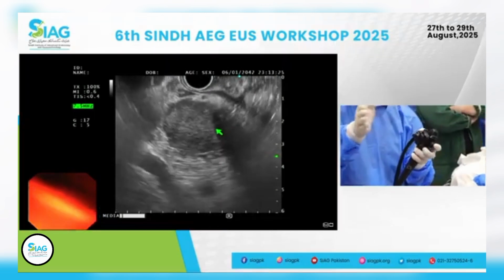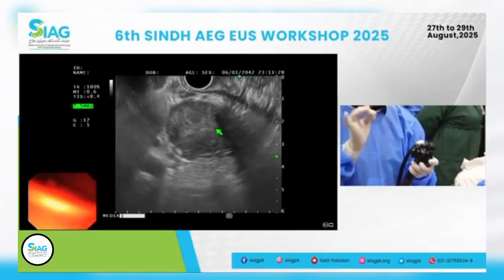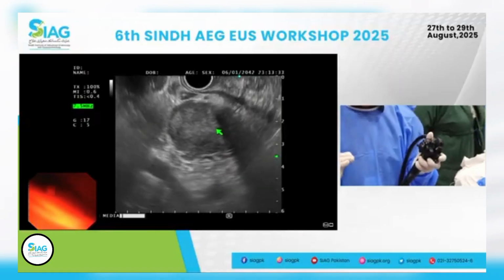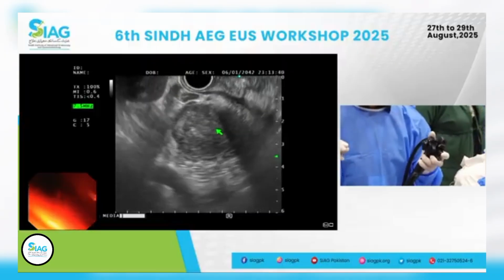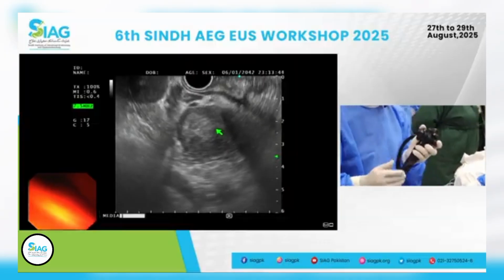So there are so many different ways to do the fanning, and use the one which is going to least destabilize your scope. So is it the elevator, the wheel? Usually those are the ones which are going to help you the most, but make sure that it's not going to affect your position too much.